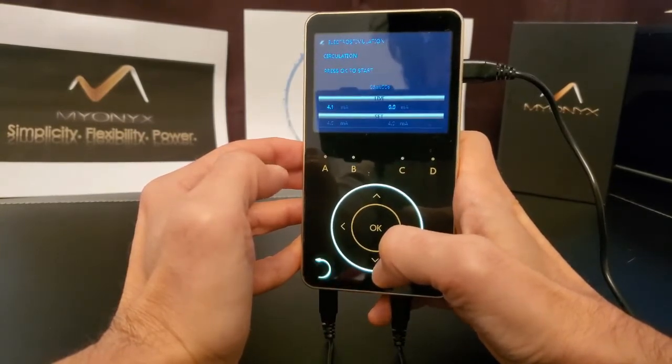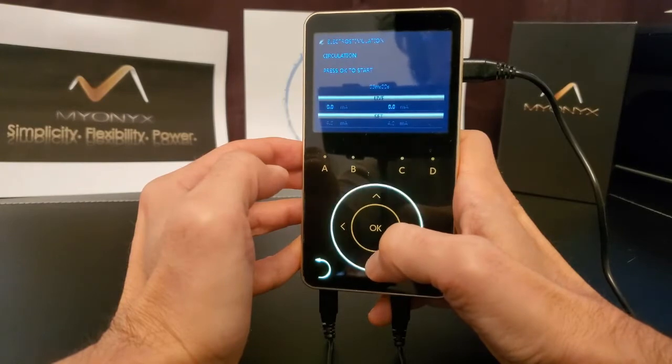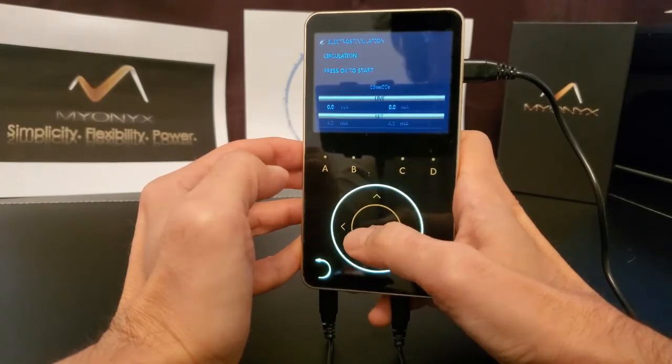Once amplitude is set, you are now ready to start a session. Click OK to start the session.